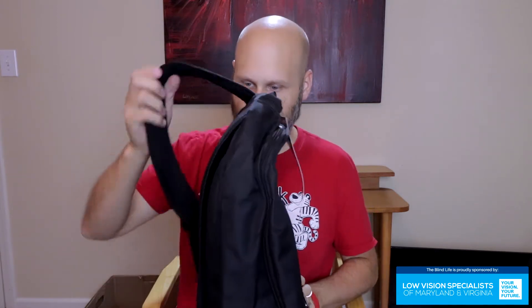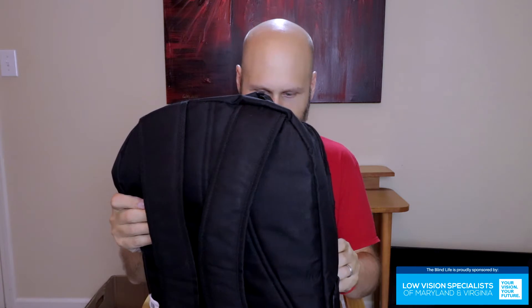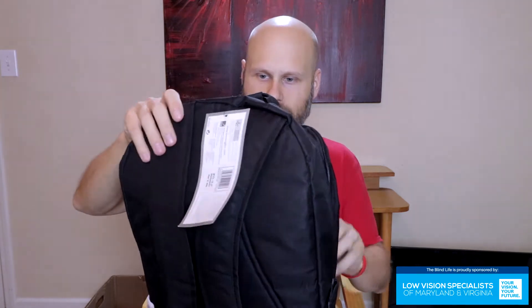You get this backpack — this is a super nice backpack. It has all types of pockets, straps, everything you're going to need to travel back and forth to school or to work. You can carry your CCTV in here as well as a laptop, because this device connects to a computer and uses your computer screen as the monitor.